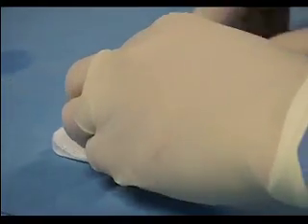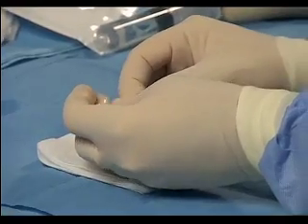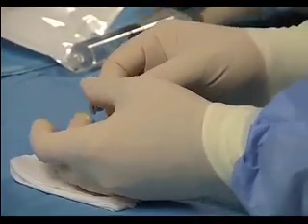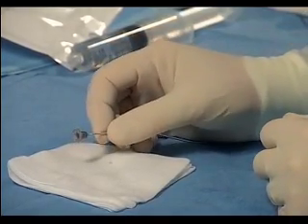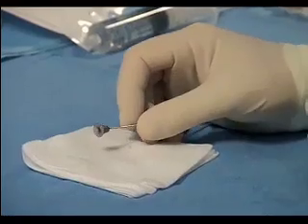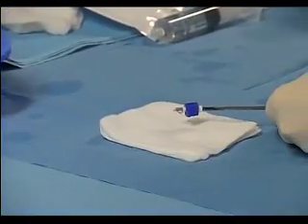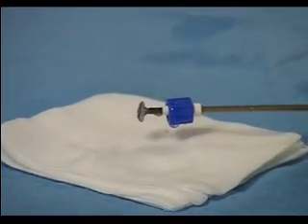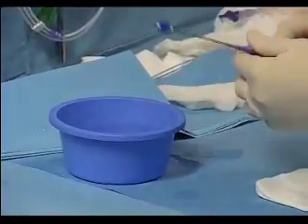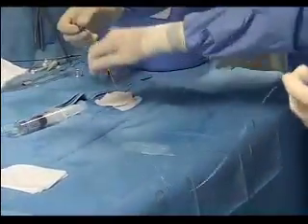Yes? Okay. So now we will load this. Well, I'm a bit surprised that I could put the wire and screw the device without wearing the glasses. I'm very surprised about that. Okay, we load it into water. This is what is going to happen on the duct when extruding. It is going to be like this. Happy with that? Very good. Okay, so let's go with the introducer.